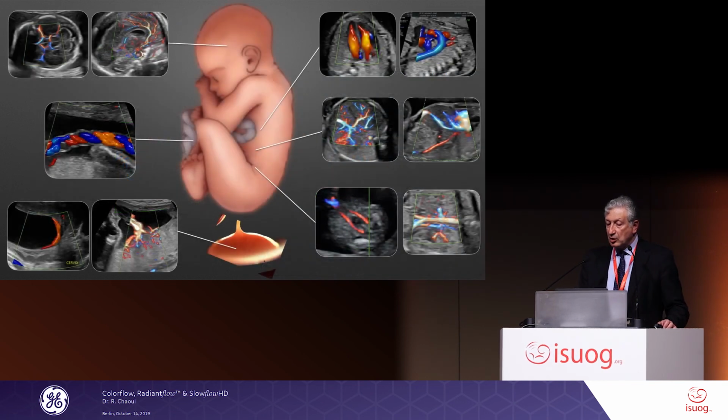So in other words, I come to the end. I showed you a few examples of the sagittal view and axial view of the brain, showed you several anomalies, worked with you on the intra-abdominal system with different views. Remember the Christmas tree sign. And last but not least, I showed you also the different aspects of the heart.